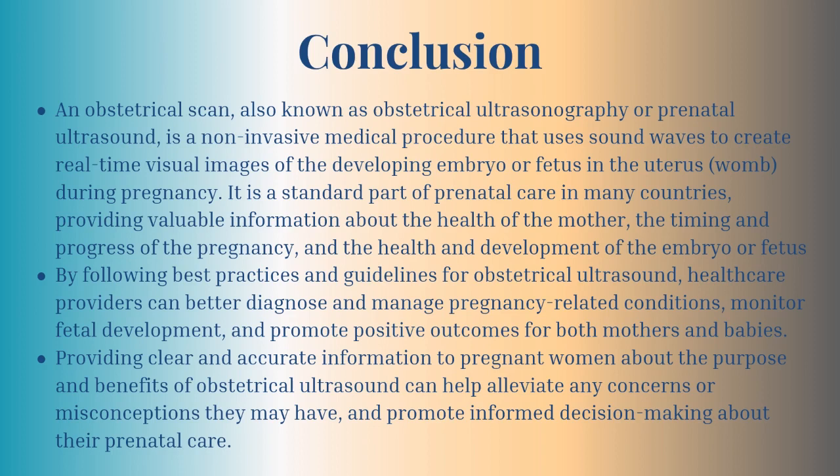By following best practices and guidelines for obstetrical ultrasound, healthcare providers can better diagnose and manage pregnancy-related conditions, monitor fetal development, and promote positive outcomes for both mothers and babies. Providing clear and accurate information to pregnant women about the purpose and benefits of obstetrical ultrasound can help alleviate any concerns or misconceptions they may have and promote informed decision-making about their prenatal care.